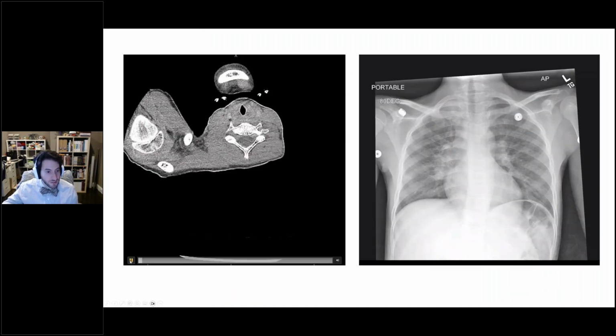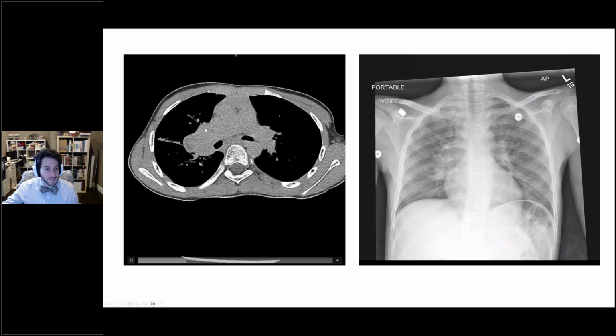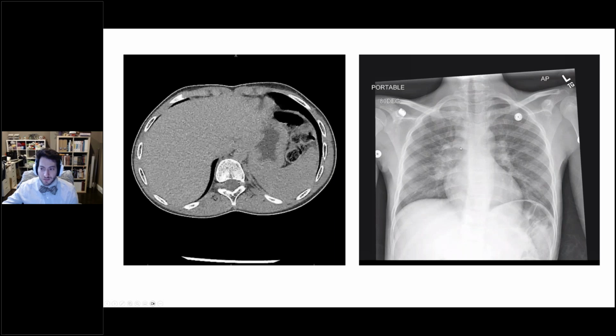I'm going to stop talking for a moment and show you some of these scans. So as you can see, as we're moving through them, here is what they asked us to biopsy. We're going to come back around. You can see it correlated over here.